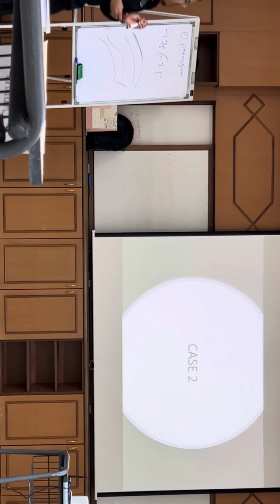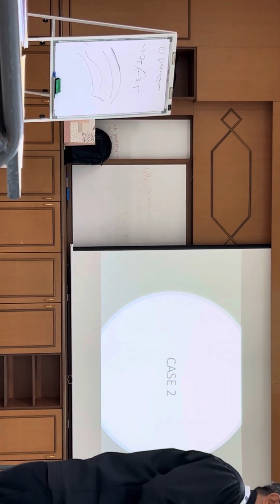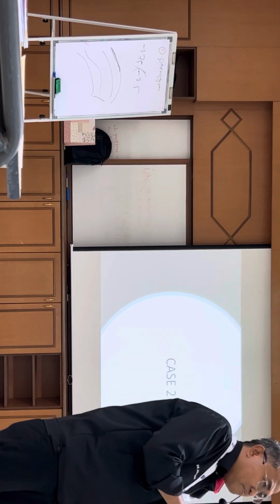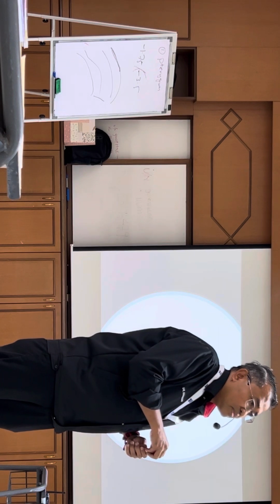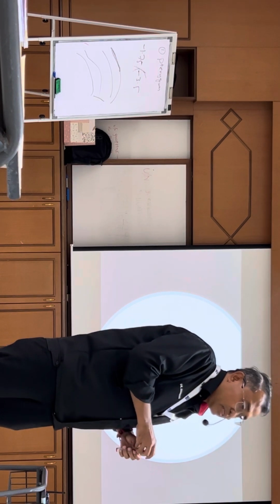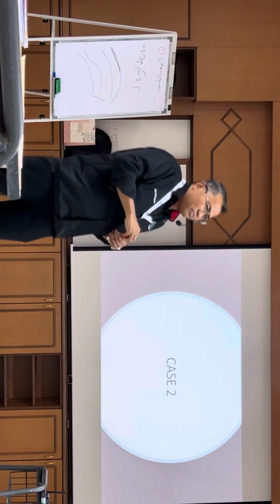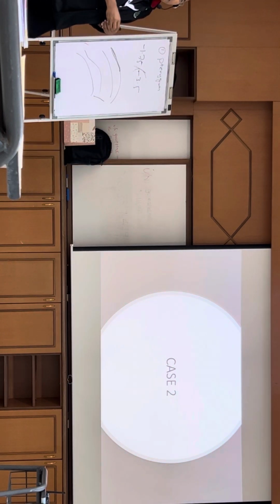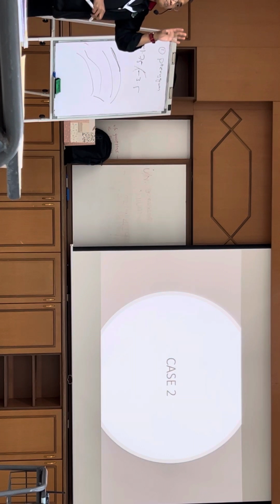For Sulcoflex, can you treat astigmatism as high as that? Sulcoflex has a range. I'm not sure about -7, but they have a range. For small residual astigmatism, the toric piggyback can. It's a big lens, that's why you have to look at it. You just put it in the sulcus, by Rayner, I think. They have their own scientists who, when they communicate with you, will calculate it for you as well.